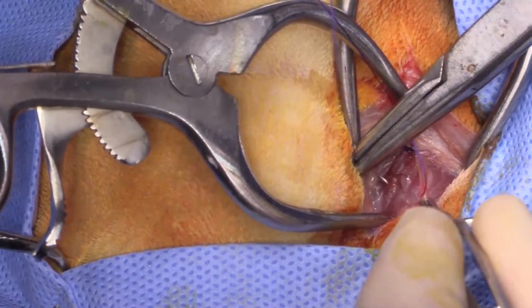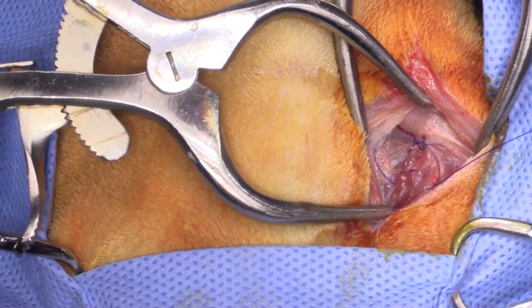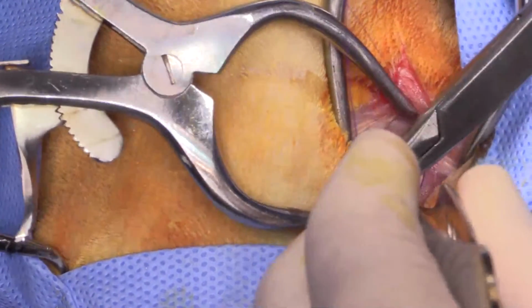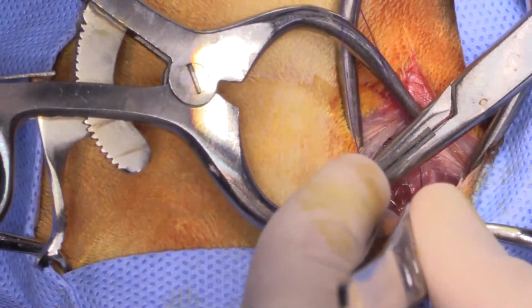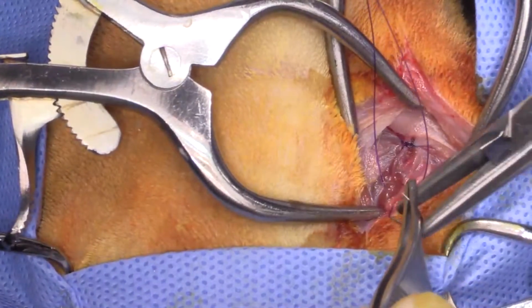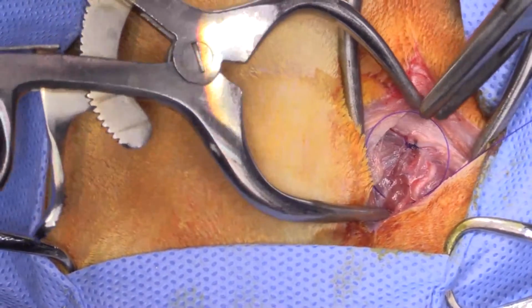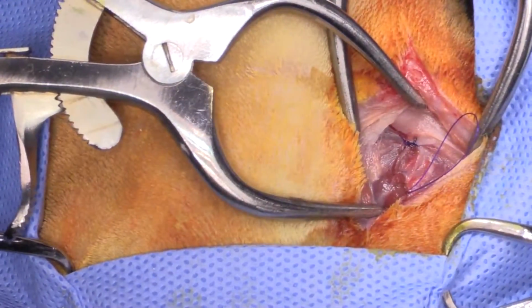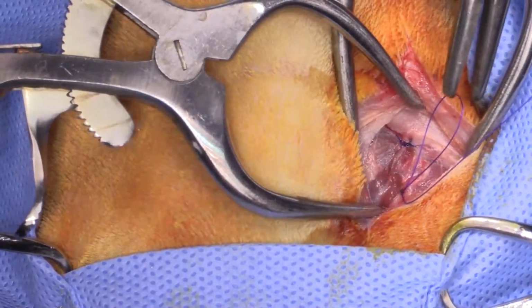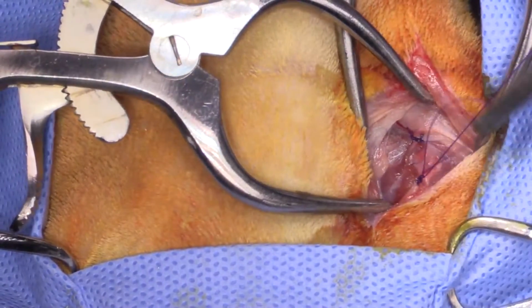Actually glad that happened with the mandibular ramus, because that's something that's really common. And so you want to be aware of that when you're making your approach. And luckily we found it after making just the skin incision and a little bit of muscular dissection. Sometimes you're practically all the way down onto the bone and then you realize that that doesn't look like a bulla, and you have to redirect your entire approach. So I caught it early enough that I was able to recover easily.